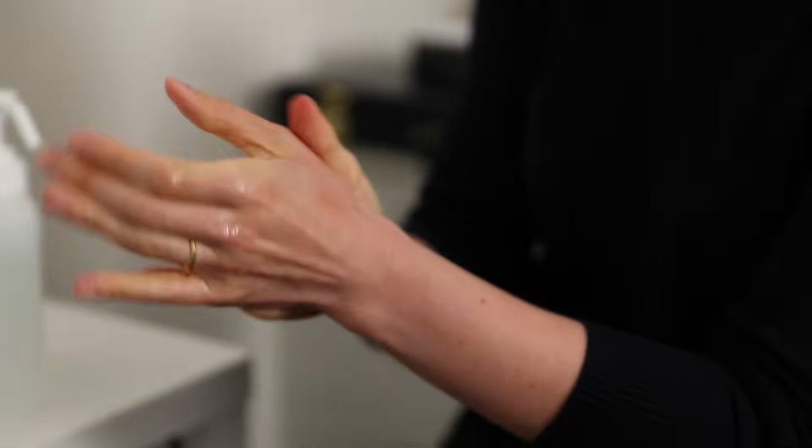After performing hand hygiene, introduce yourself to the patient and get their verbal consent to perform the exam. Sit the patient at a comfortable height and dim the room lights. For the purposes of this video, we'll leave the room lights on. If the patient wears glasses, ask them to remove these. You can remove yours too, unless you have a high prescription, in which case it's better to leave them on.